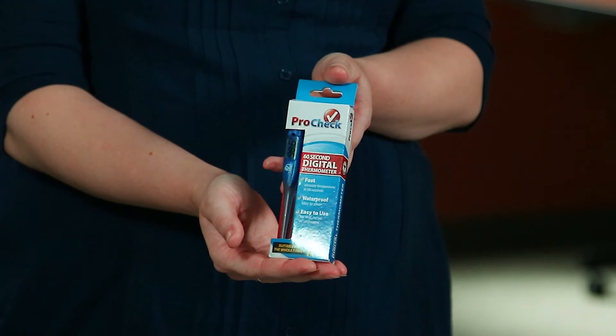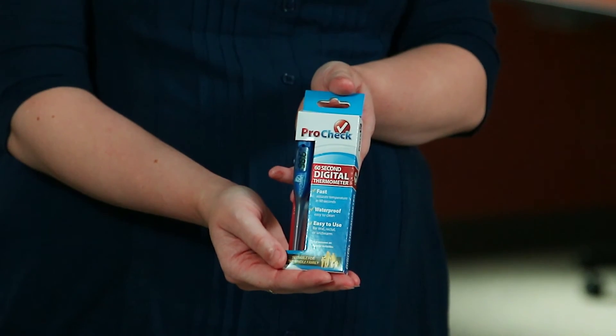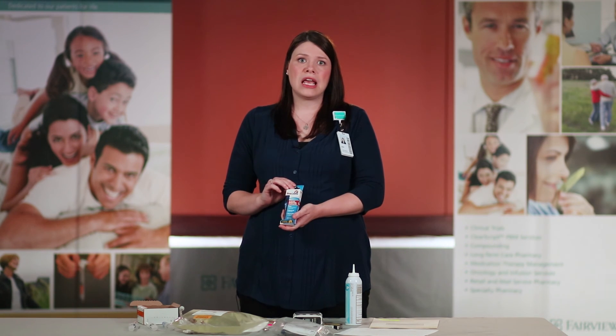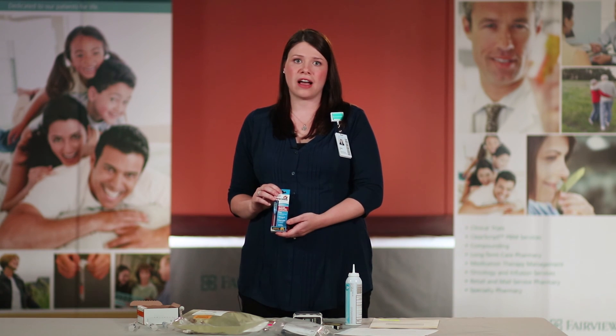We do send out an oral thermometer during our first delivery. This is to monitor your temperature twice a day — once right before your infusion and one hour after your infusion. We'll discuss that in chapter nine.